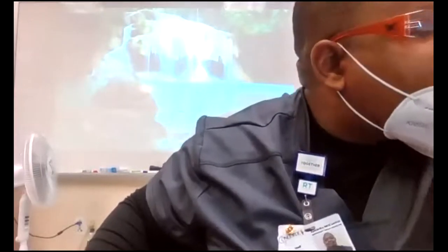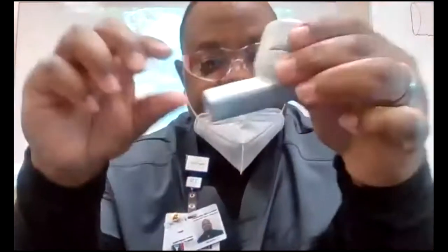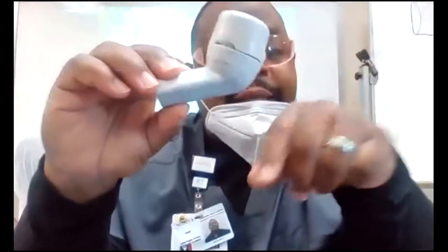Acapella flutter device, and this is the old school flutter device here. This is also a flutter device, which encompasses a steel ball. There's a steel ball that's supposed to go in, a really heavy little steel ball. And when the patient blows in here, it makes the ball rise and fall. That rising and falling does the same thing as the acapella.